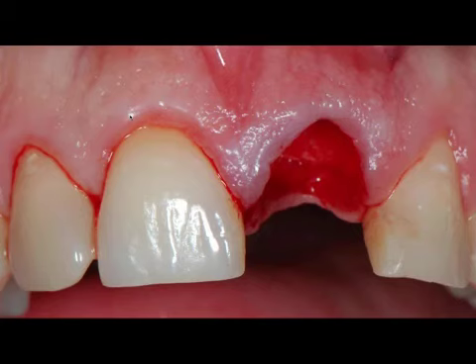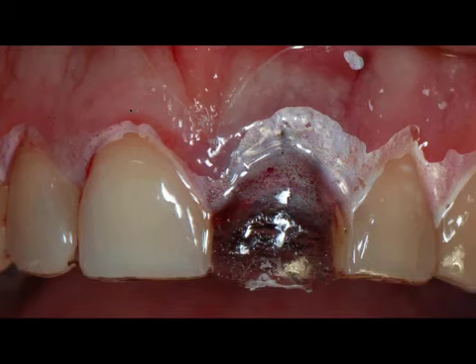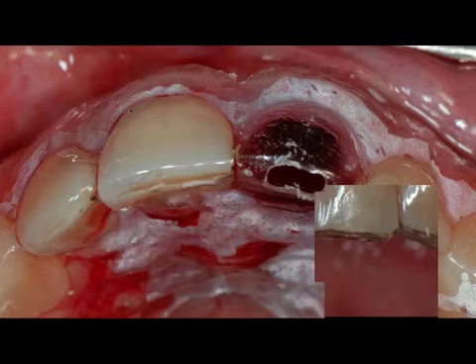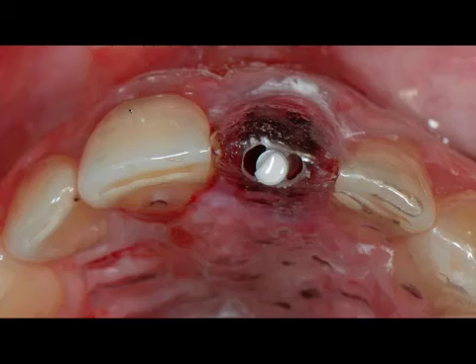Our socket is curetted. We make sure that everything is nice and clean, and we're ready to begin our osteotomy. We use a drill guide, in this case an Essex appliance that was preformed, and we use a hole at the bottom of that Essex appliance in order to guide our osteotomy drills, to get proper inclination of that implant. That's our first twist drill in place, perfectly positioned along the incisal edge of the tooth.